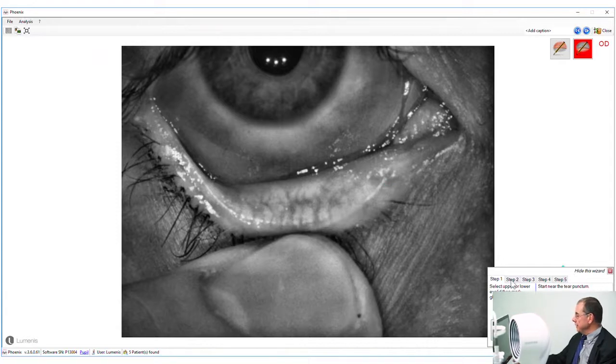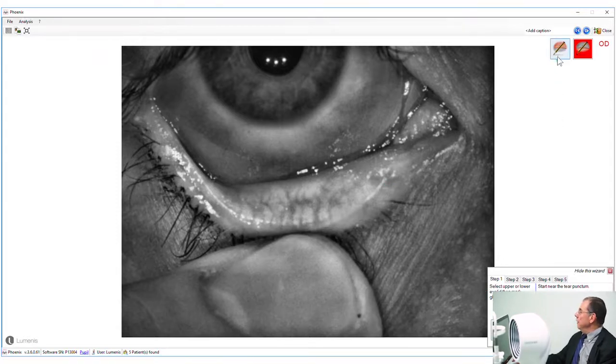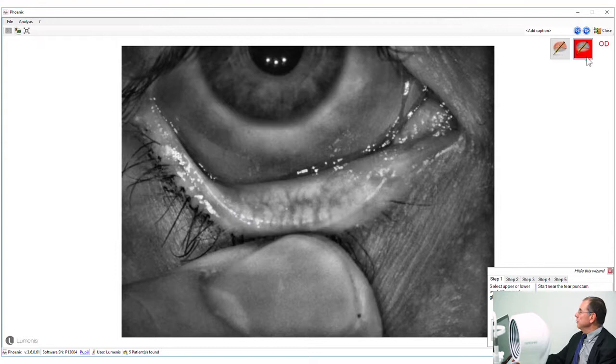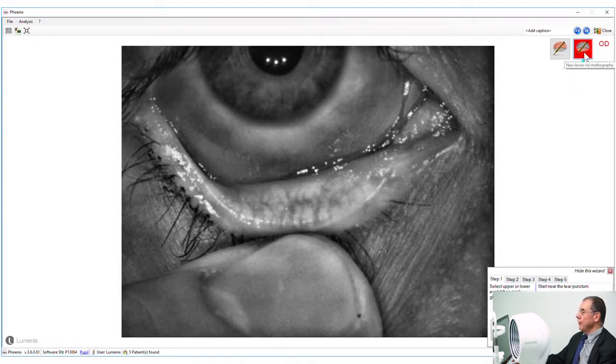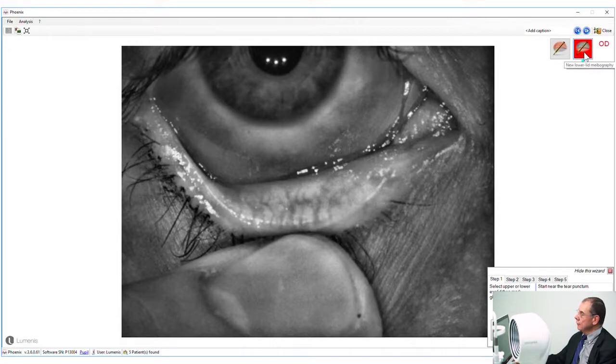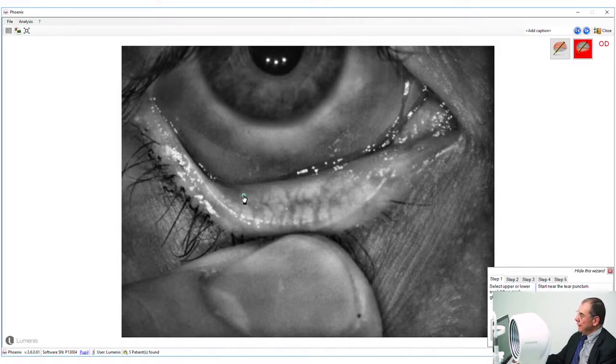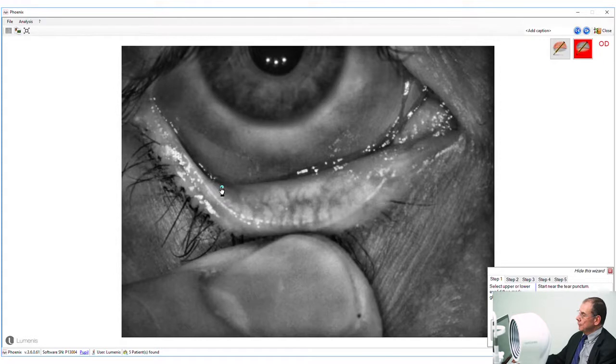The first step we choose whether we are doing a lower lid or an upper lid, so automatically it defaults to the lower lid. We then have the mouse with a little blue dot and what we're going to try and do is put it into the four corners where we can see the meibomian glands. It's pretty easy to do.